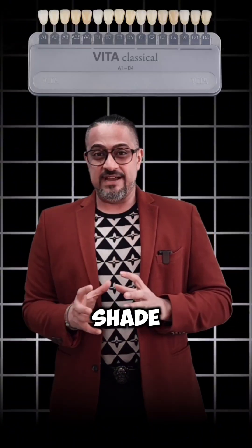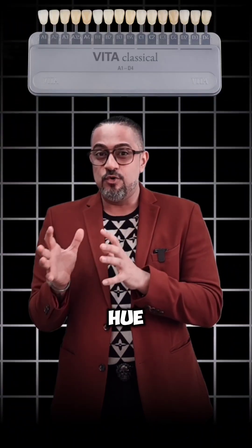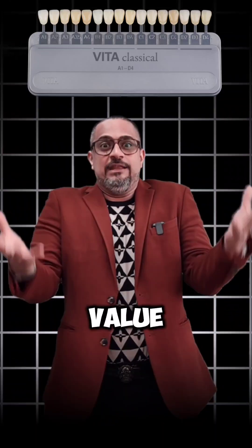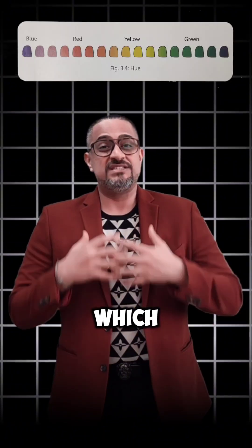The Vita Classic Shade Guide was designed on the basis of hue and chroma with very little attention to value. So what is A, B, C, D? That is basically your hue, which is the color.